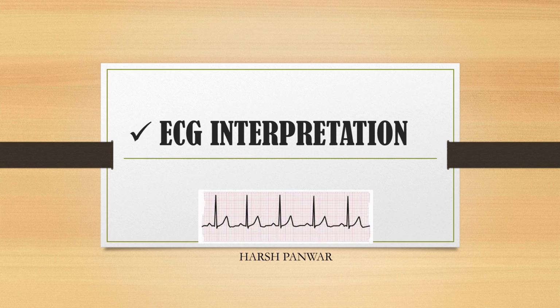Whenever you go to the ECG, you see the patient's arms with a red lead on the right hand, a yellow lead on the left hand, a green lead on the left leg, and a black lead on the right leg of the patient. The black lead does not have any function in the ECG record. It acts as a ground electrode to prevent any electrical trauma to the patient.